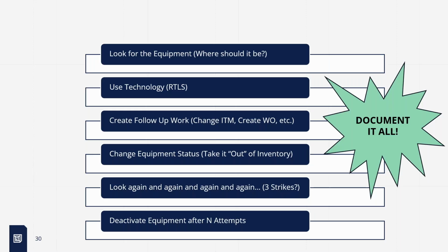Somebody put another sticker there, so what do you do with it? Or somebody doesn't want it visible to the patient, so you have to hide stickers on certain things and make them easy to find, but hide them. So there are lots of rules to adhere to when you're doing things like that.